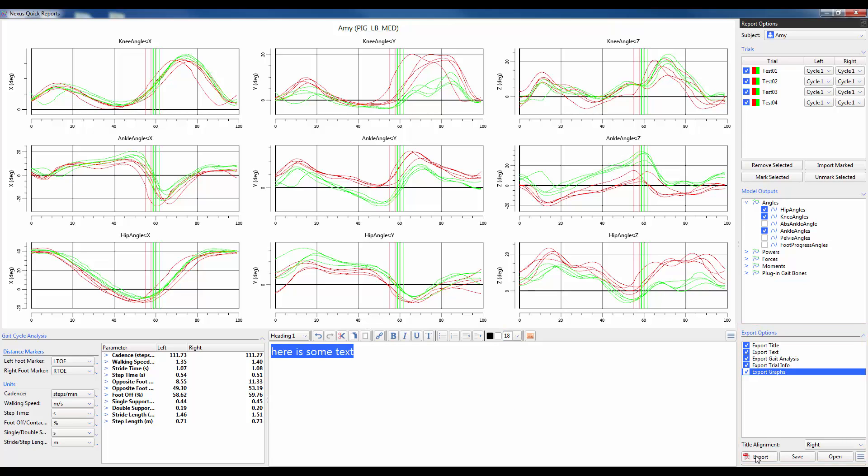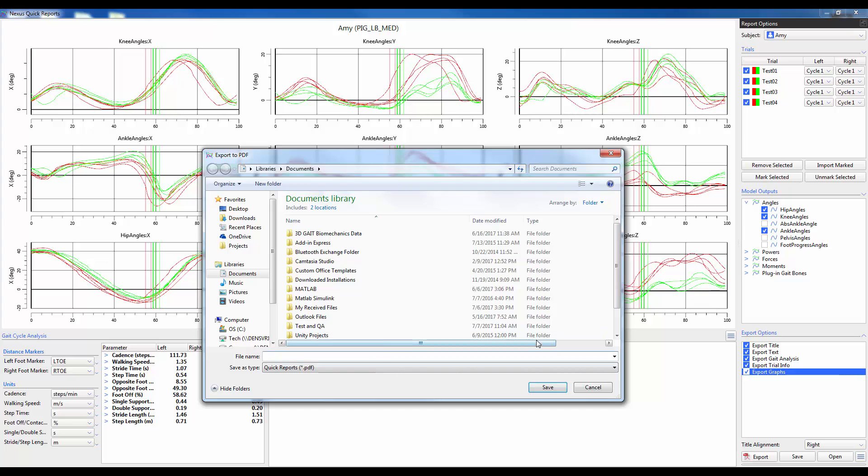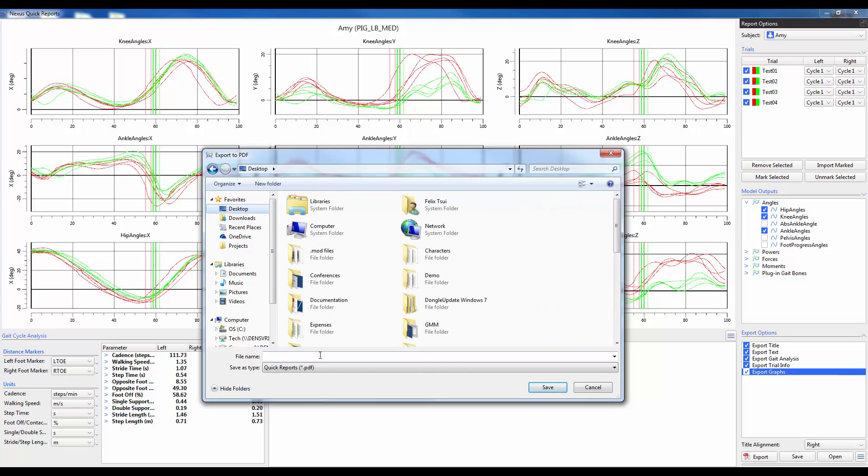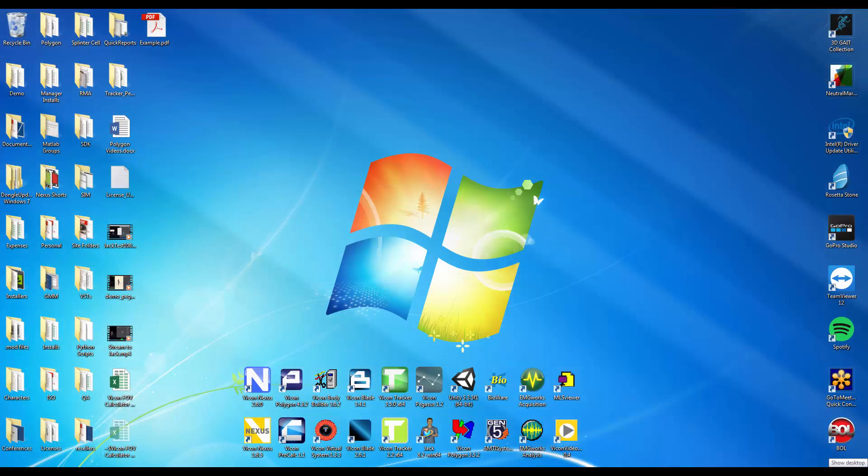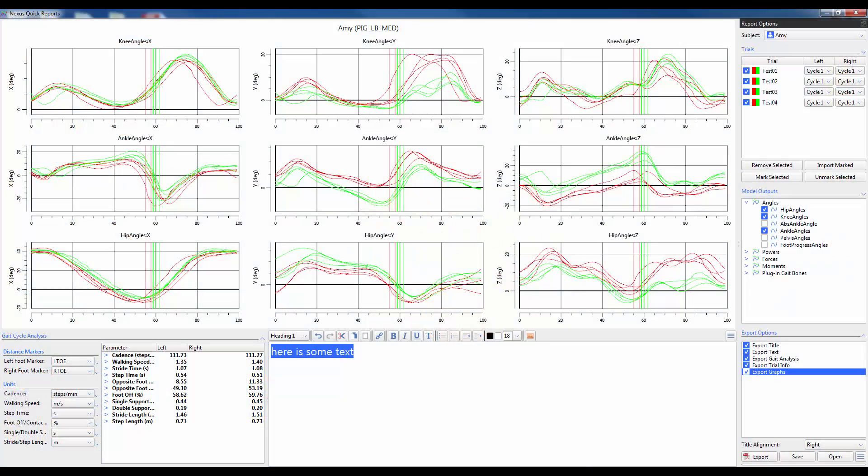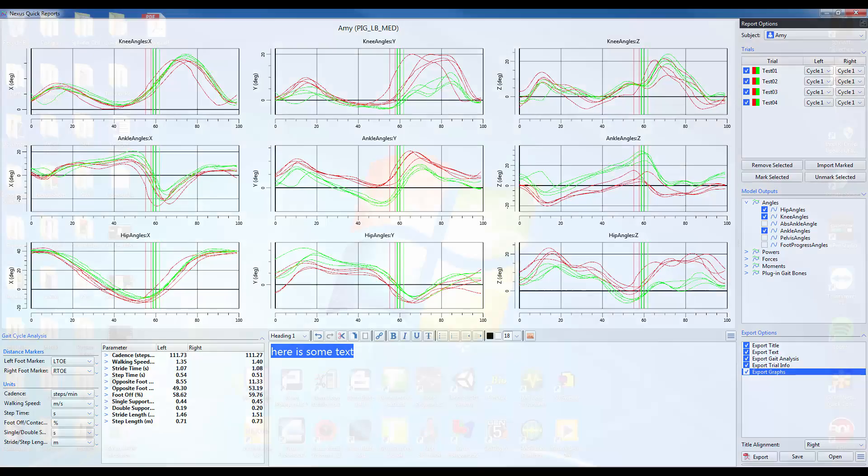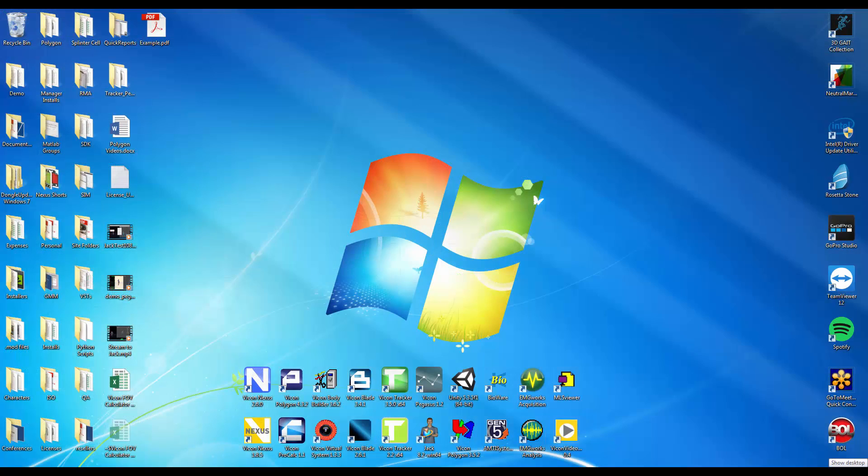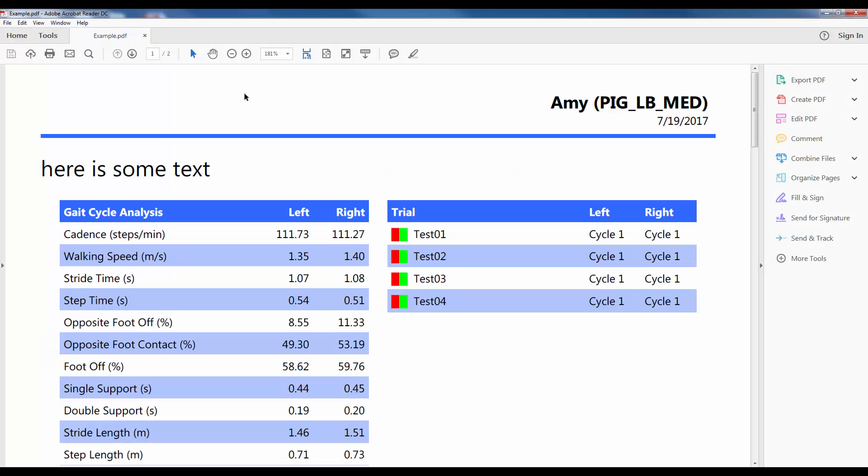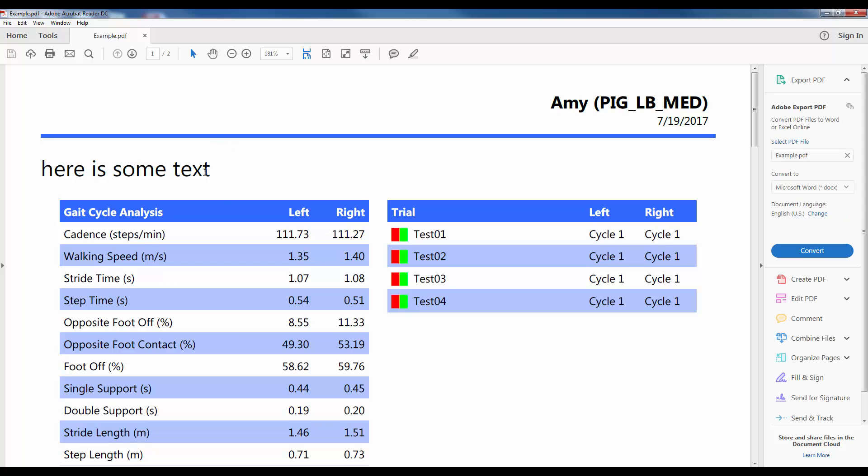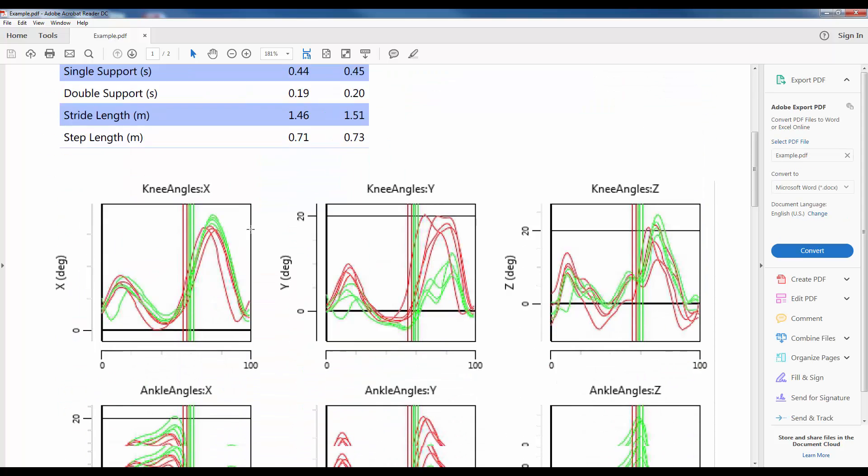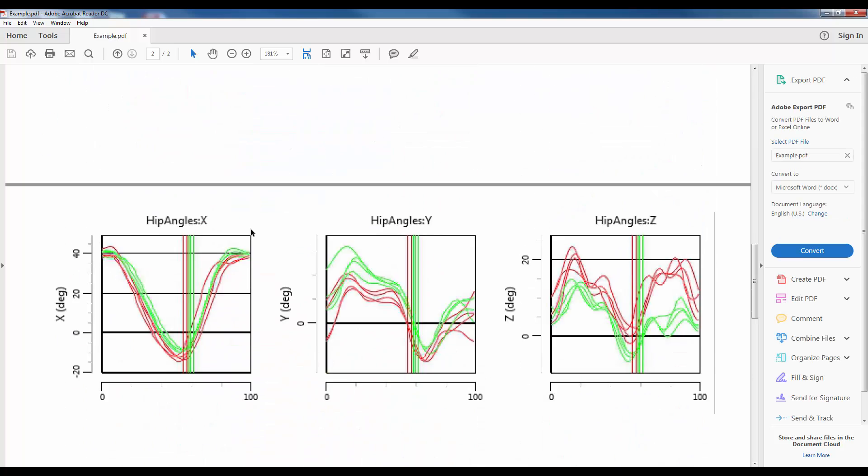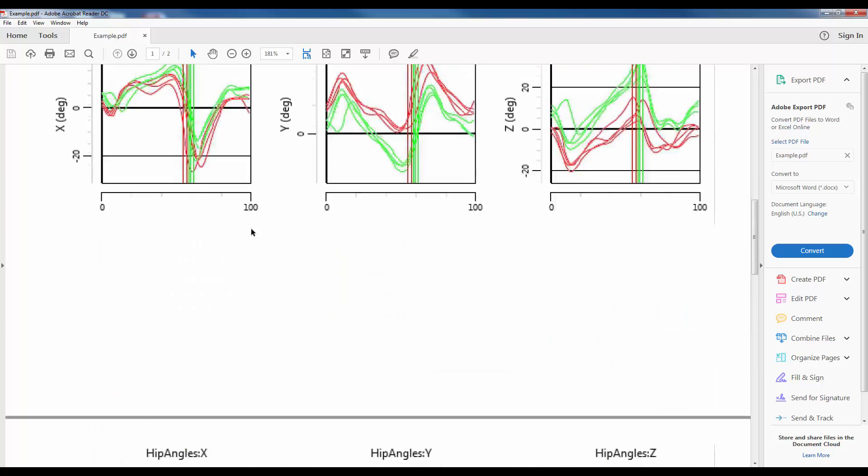When I'm ready to export, I simply click on the export button, navigate to the folder in which I want to save that report and then give it a name. I can then go to the desktop and actually show my report. So I can see that I've got my text, then my gait cycle analysis and then my model outputs down below.